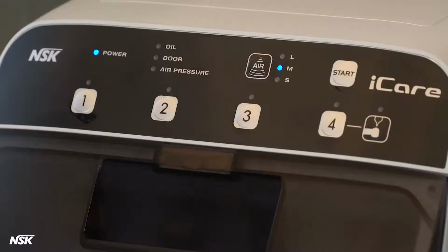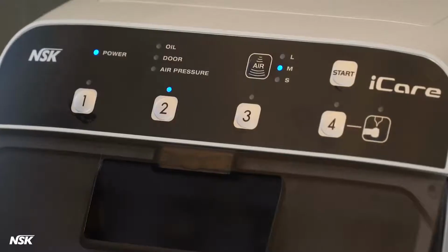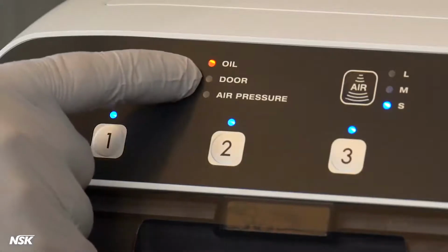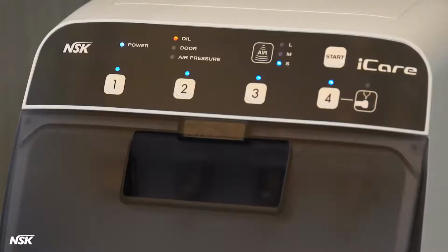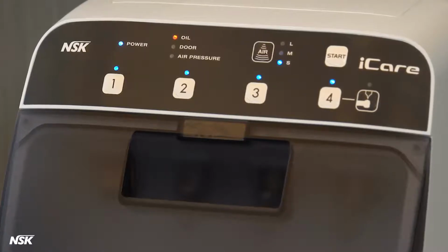Your iCare also has a display on the control panel. Power LED. This shows the power is on. Port LED. This illuminates when each port is activated. Note, this light will blink during the lubrication process and turns off when the lubrication cycle is completed. Oil Error LED. This light comes on when you are running low on oil. You still have enough for another 300 to 400 cycles, but it's time to reorder more oil.